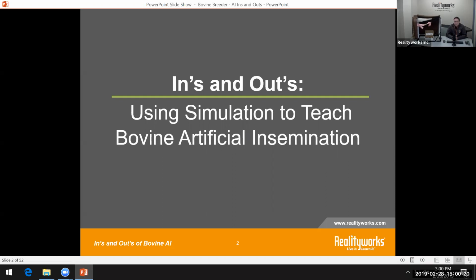We're going to get started right now on walking you through our Bovine Breeder product, which I have next to me here, but also to talk about some of the main takeaways for teaching bovine artificial insemination.